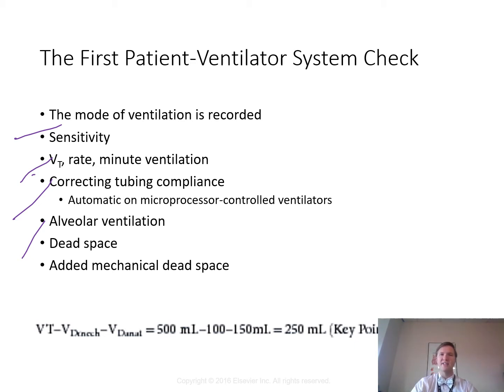And we're bypassing the upper airway with an artificial airway, right? So when we bypass the oral pharynx, the nasal pharynx, and then the top part of the trachea, we're actually reducing anatomical dead space by about half. Right, that's pretty significant. So they're going to have more effective ventilation automatically when we bypass that upper airway. So using a Y connector, flex tubing between the Y connector, the ET tube, and HME, it adds mechanical dead space.